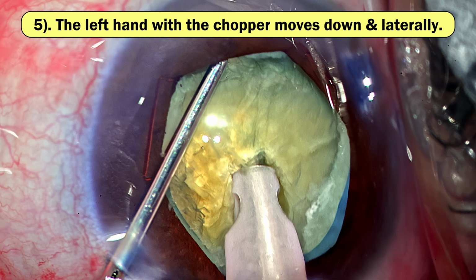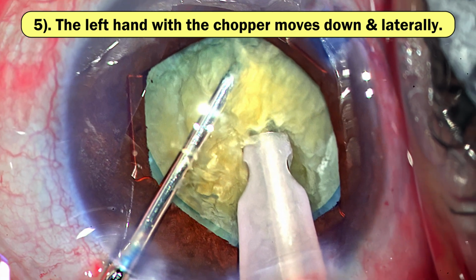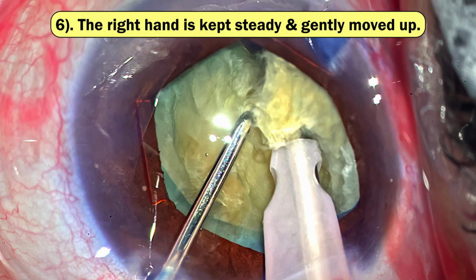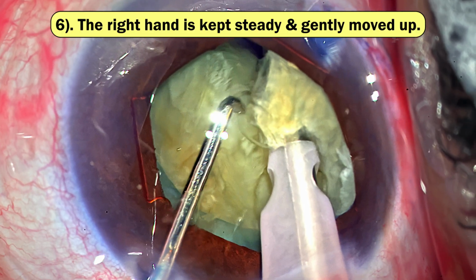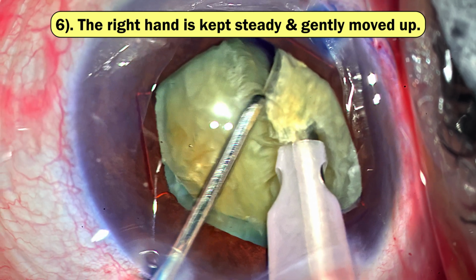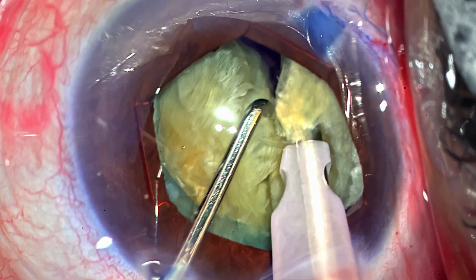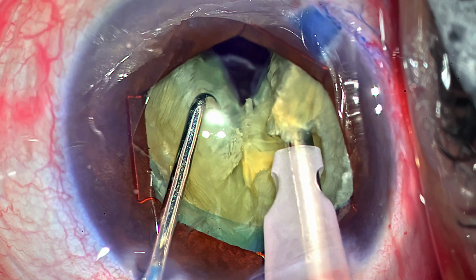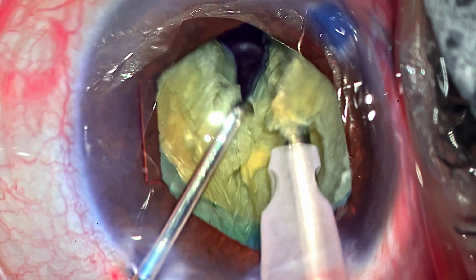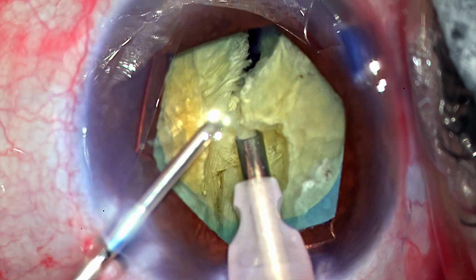Number 5, the non-dominant hand with the chopper is kept just in front of the phaco tip. It moves down and then laterally. The right hand, which has the phaco tip, is holding steady or is gently moving up. It's not moving down. So the vertical chop, I've tried to divide into 6 maneuvers. It's almost like watching an action film in slow motion. So you're going to break this step into 6 smaller maneuvers, which are going to help us master the finer nuances of each step.